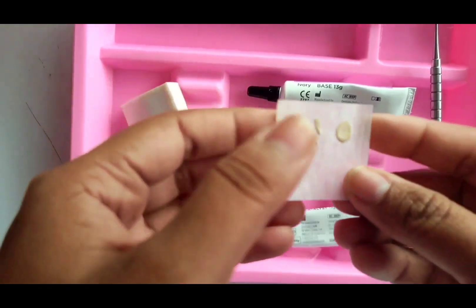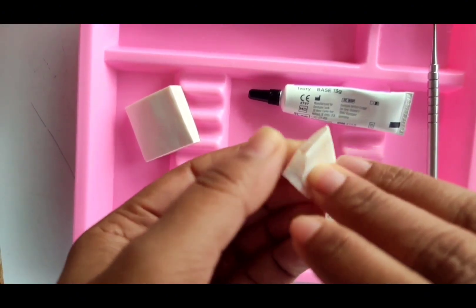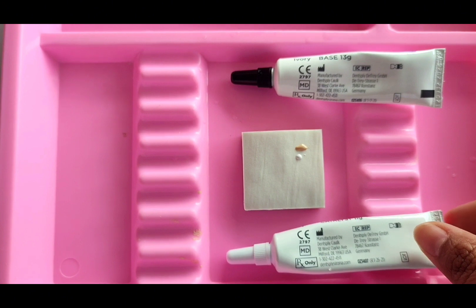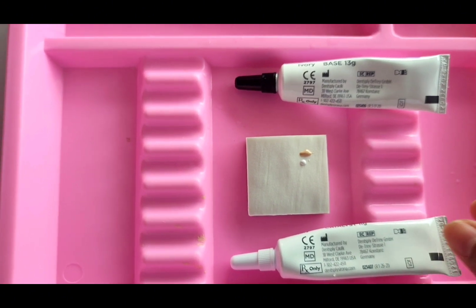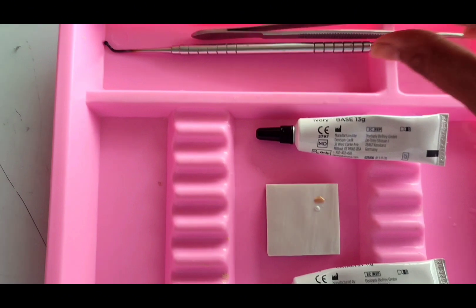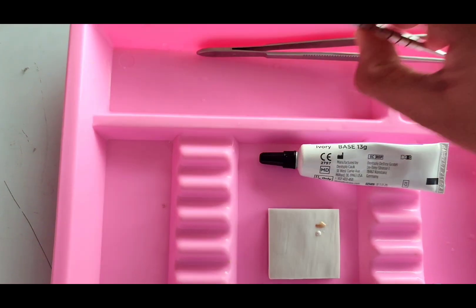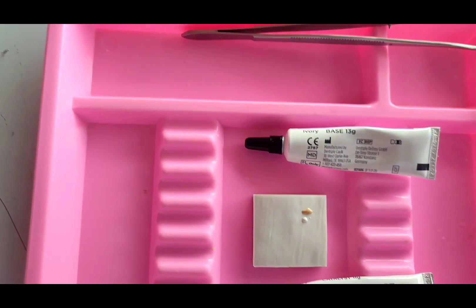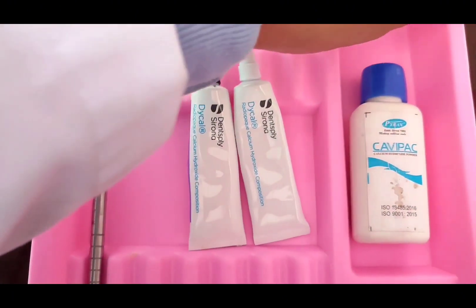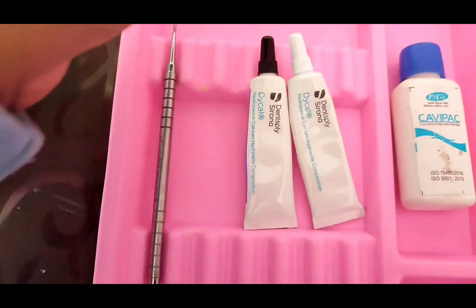The parchment paper is one-time use — just tear it off and dispose of it. You can see there are no materials sticking onto the next paper, so it is very helpful while mixing any kind of cements. Remove any set excess from retention areas, enamel, or margins with a sharp spoon excavator or bur. Place the desired adhesive, base, or restoration. At the next appointment, assess pulp vitality radiographically every three to six months or as needed after placing Dycal.